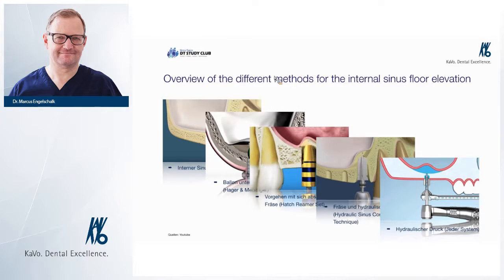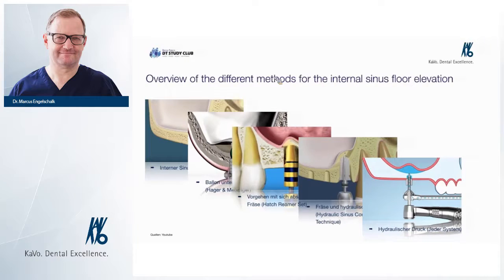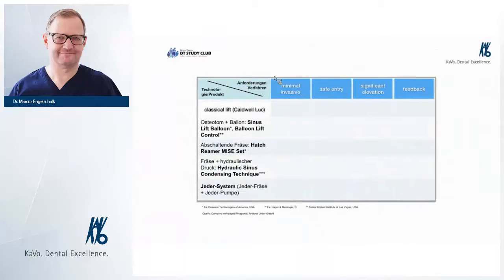Well, and the intraoperative control should be very clear, to know if the membrane is still okay or do we have ruined it already. So this is very important. Yeah? And for the internal sinus floor elevation techniques we have on the market.